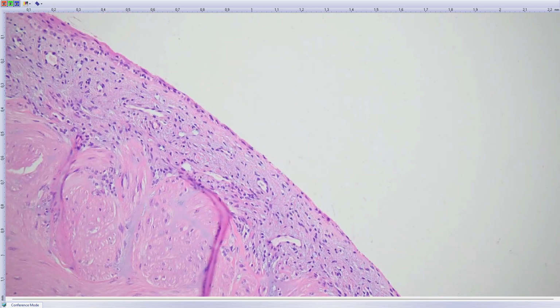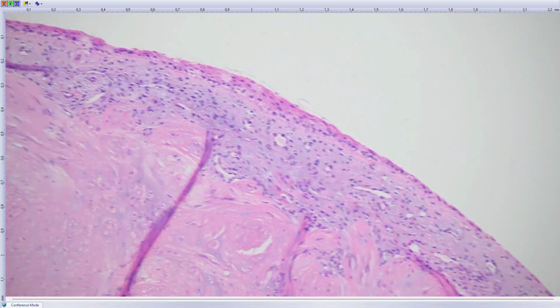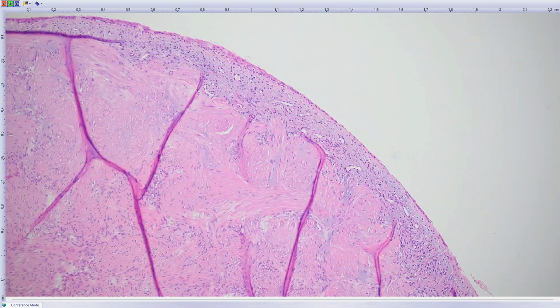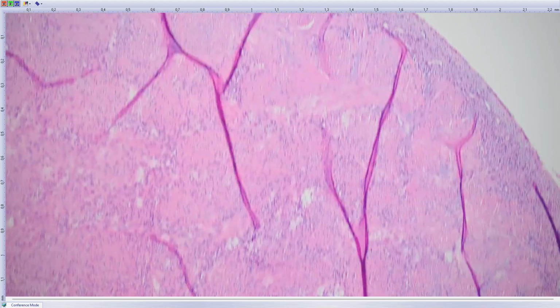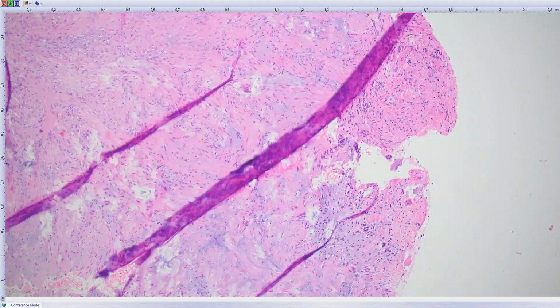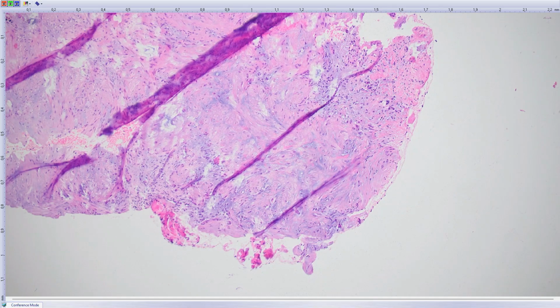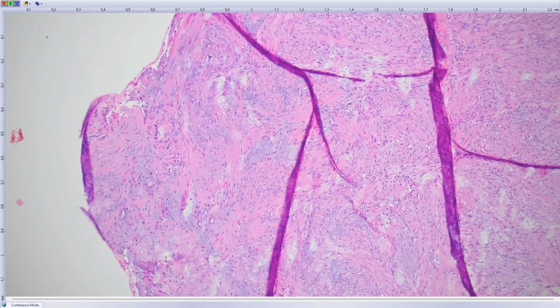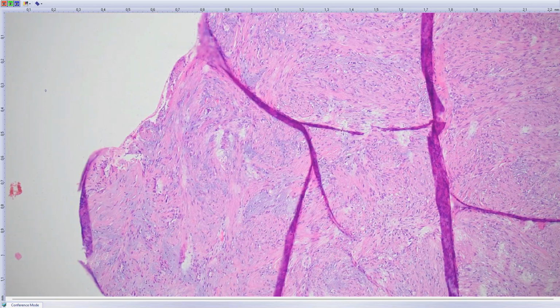Anyway, the one in the middle at the very periphery, the darker cells with less eosinophilic cytoplasm, they look more undifferentiated, so that's the second component. So this is basically a biphasic tumor. And then a very helpful clue is this bluish myxoid, chondromyxoid-like stroma. So this basically looks like a myofibroma.